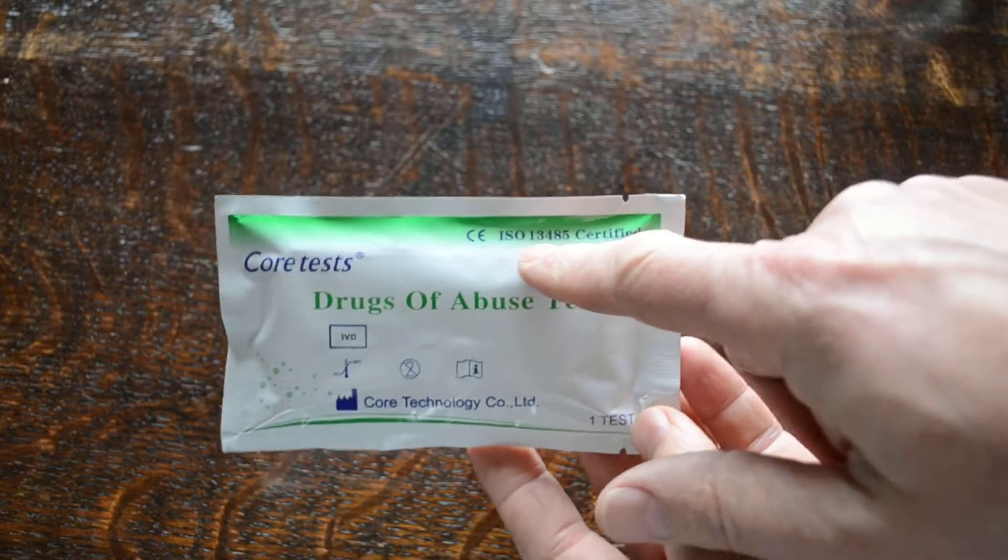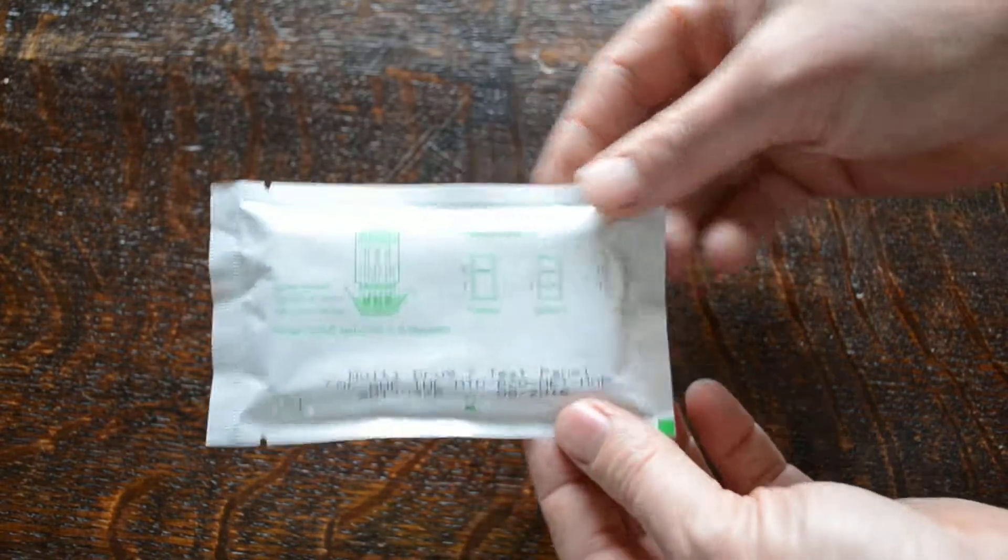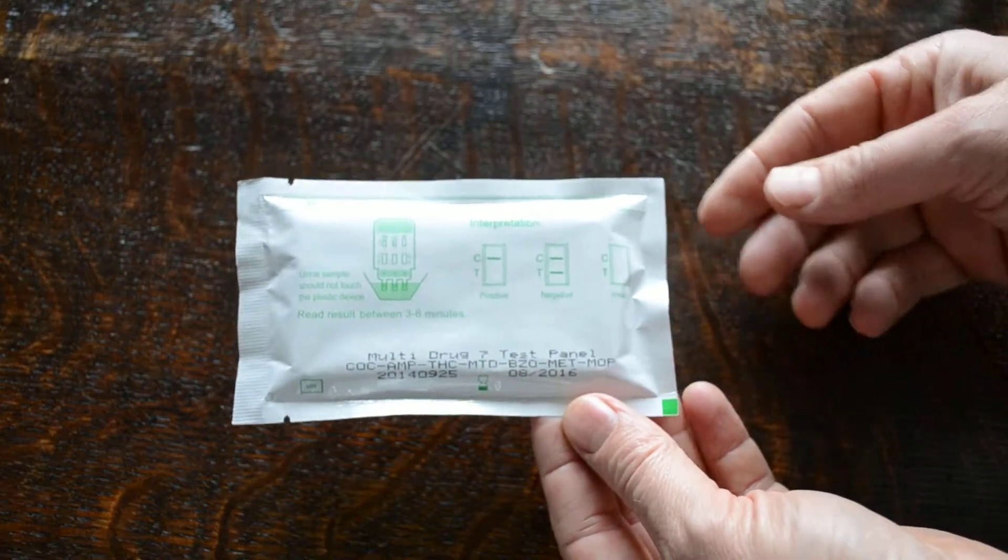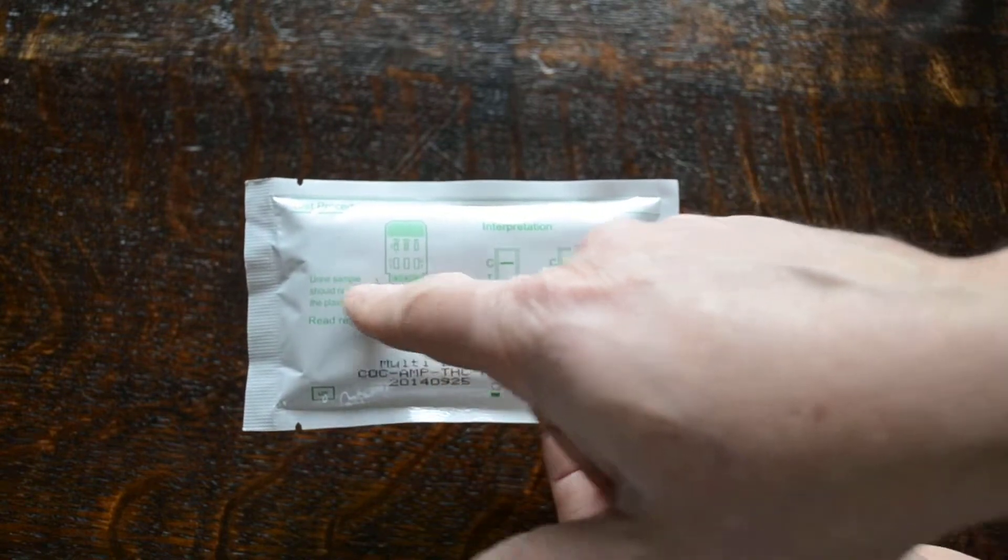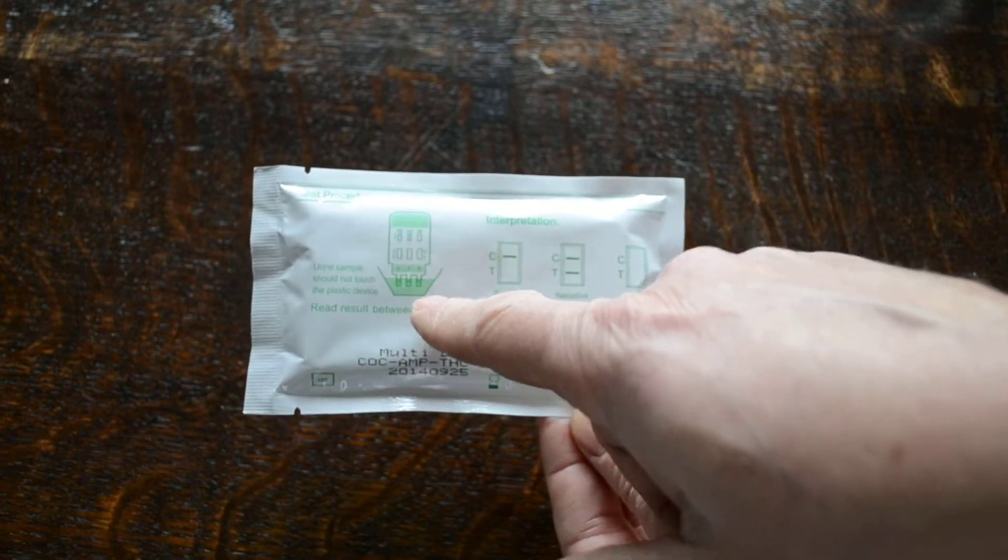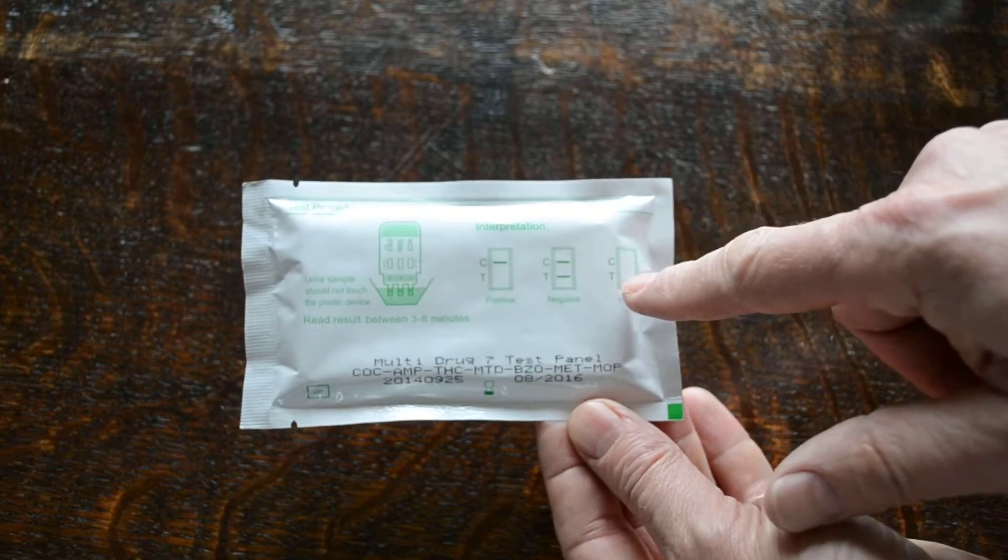CE certified and ISO 13485 quality certifications. Turn the foil over so you can see the reverse. Very nicely produced foil. Gives you basic test procedure instructions and how to dip the panel into the urine sample and indicative interpretation results.